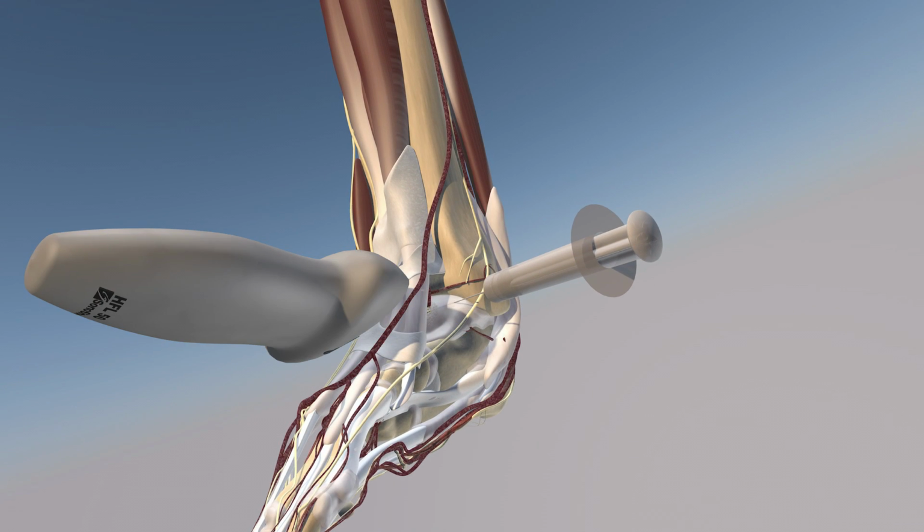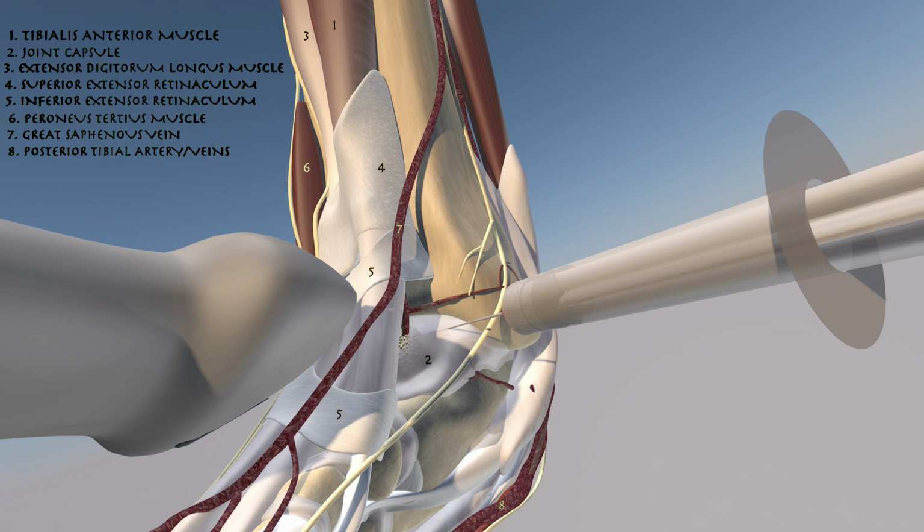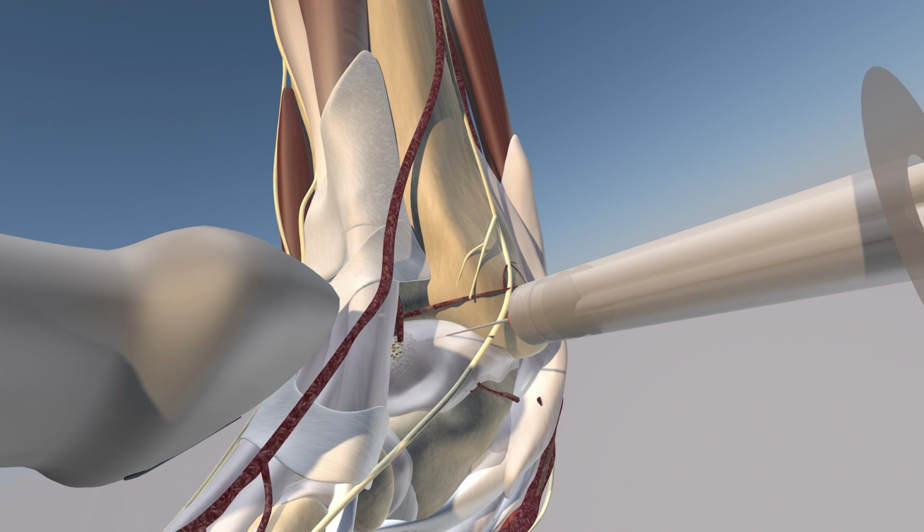Here we're going a different approach now. We're trying to slip the needle essentially underneath the tibialis anterior tendon, going right towards the cartilage surface of the talus, but obviously you want to avoid nicking the surface. Also during this approach, you are heading towards the dorsalis pedis artery, so you have to be cognizant of that structure and obviously avoid it, as your needle should be lateral and underneath that structure.